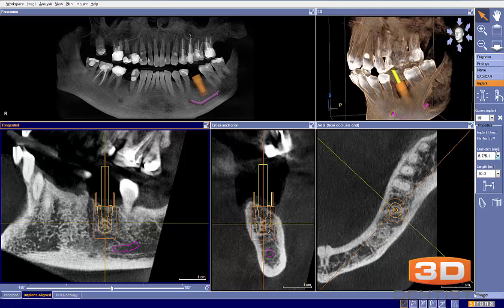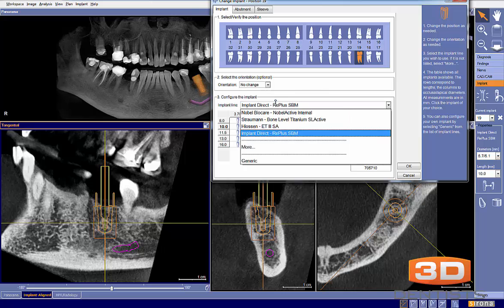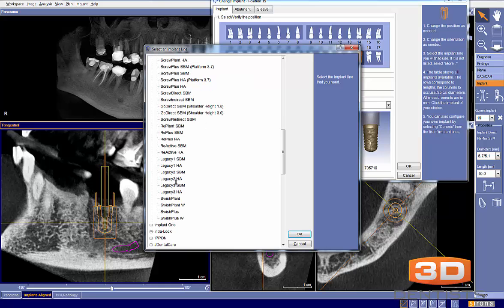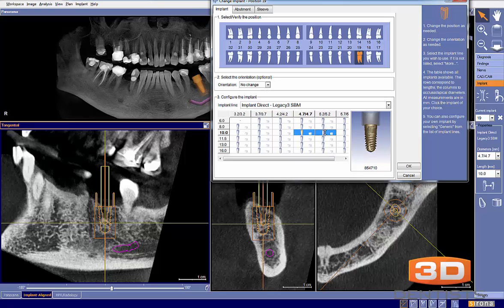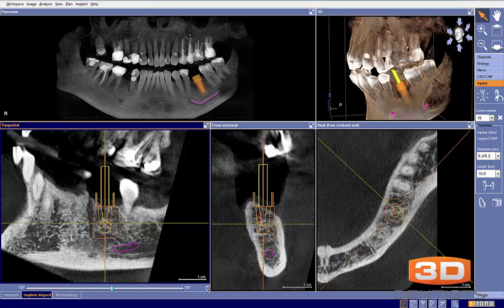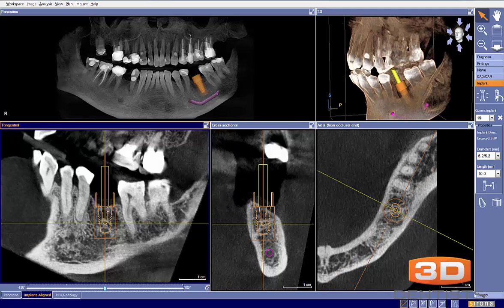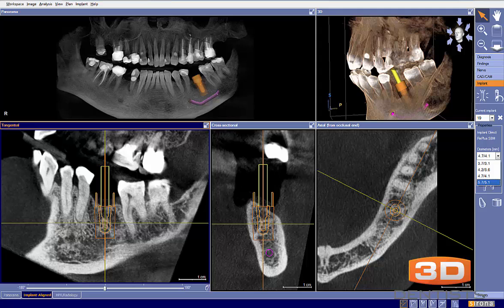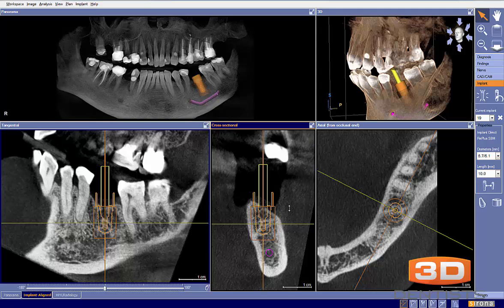Another thing I would consider is that this looks like an Implant Direct implant. Implant Direct has their Legacy 3 implant, and one of the benefits of that line is we could consider using a 5.2mm implant, which I believe would be more than satisfactory width-wise here. The benefit of the 5.2mm implant is it uses a 4.7mm connection, which gives us a platform shift built into the implant — and I am a big believer in platform shift. The Replus line doesn't seem to have a 5.7mm implant available in the catalog yet, but that's a personal preference.